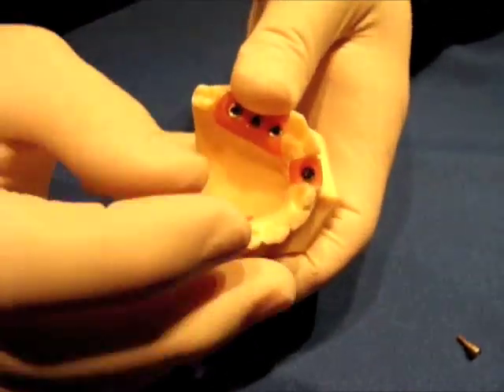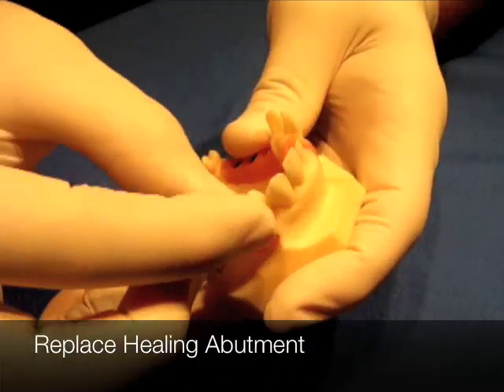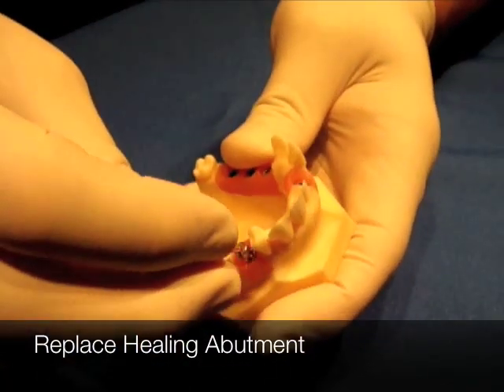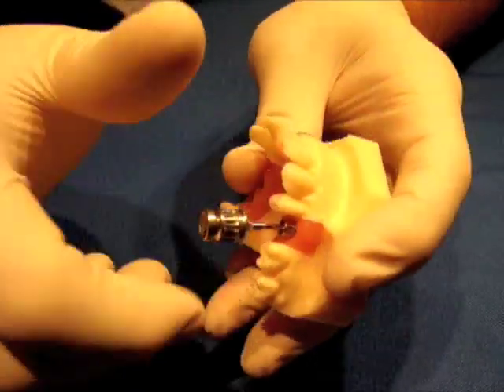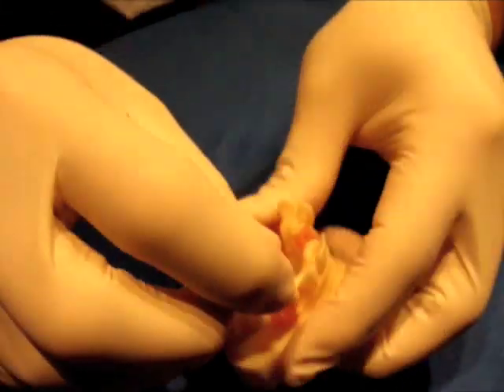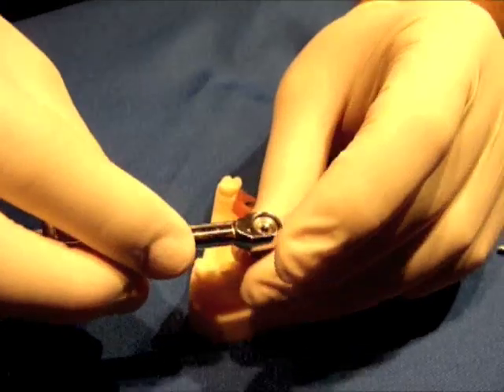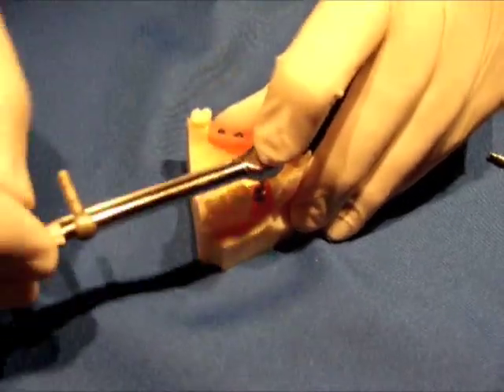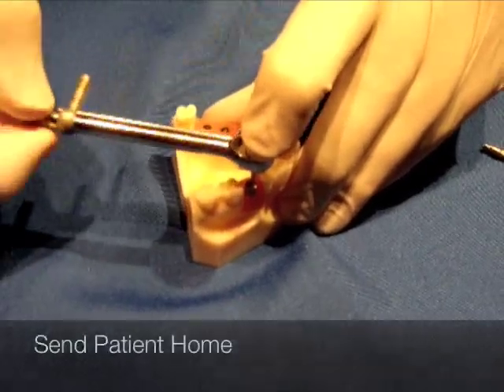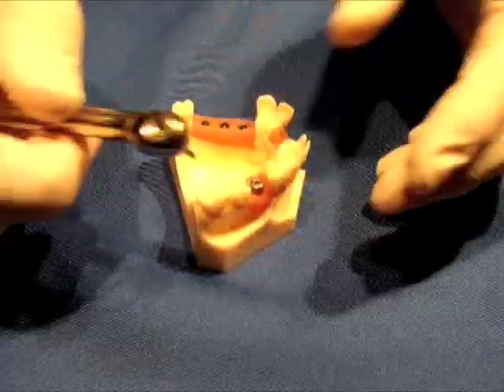I'll take this out with the same UniGrip driver. Notice I'm not using the torque wrench yet — the torque wrench is used only usually during the insertion of the crown. I place this back in and the patient would finger-tighten it. Sometimes I'll tighten these down to about 15 newtons — you can insert it back on the wrench and tighten down to about 15 newtons.